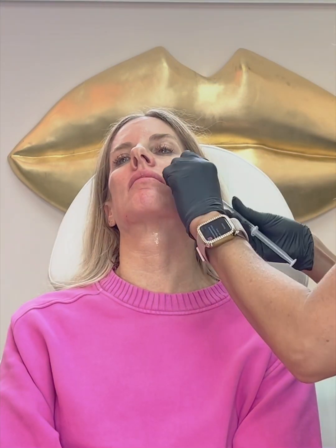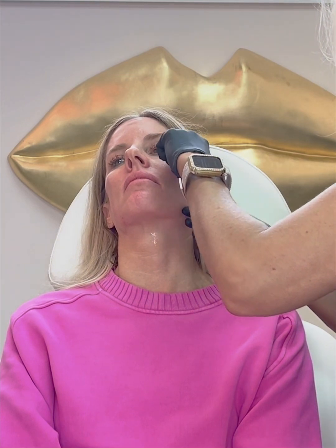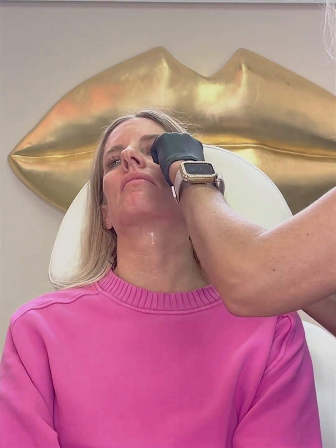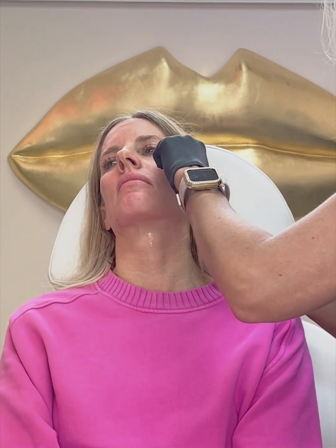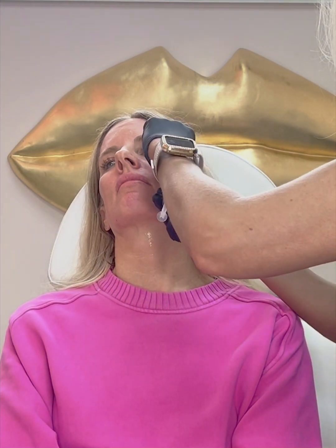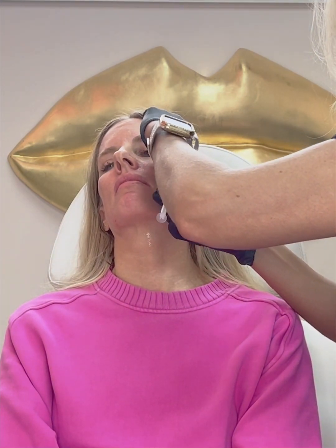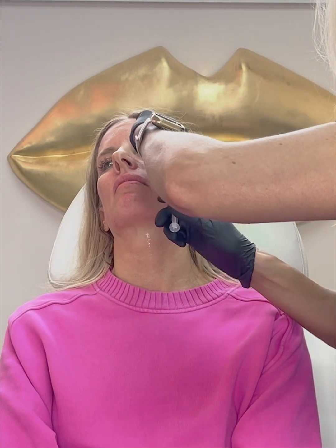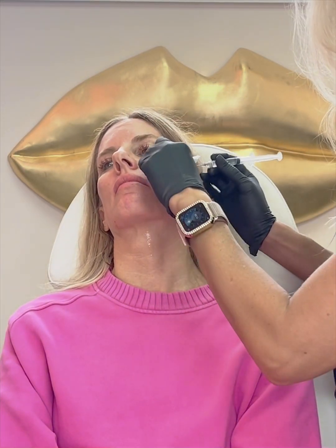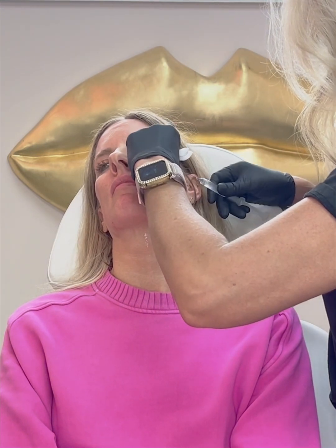I absolutely love Sculptra. I love what it does just for overall skin benefits, as well as lifting and providing some subtle volume. But as you can see here, I treated her temple, and now I'm working in her mid-face, her cheek area. She had a few main concerns, more accordion lines to the lower mid-face. However, we needed to get her a little lift to actually help to lift and pull that back up a little bit. You'll see here shortly that I actually do go into the area of concern as well. But I'm just spreading this product right out where I placed it and going ahead and doing her first massage for her. And at the end of the video, I'll do the total face massage of everywhere that I've treated.